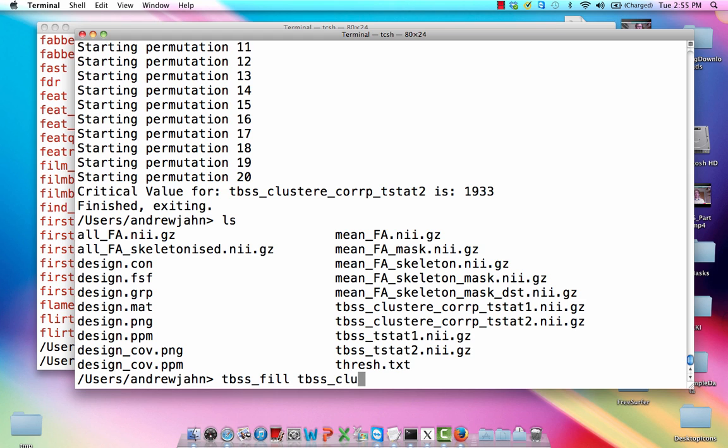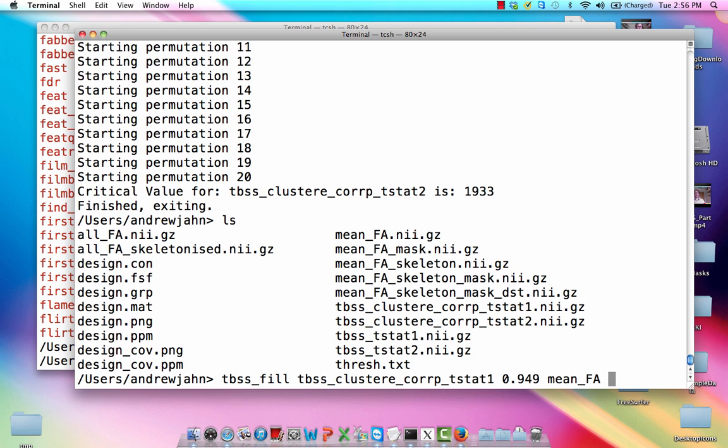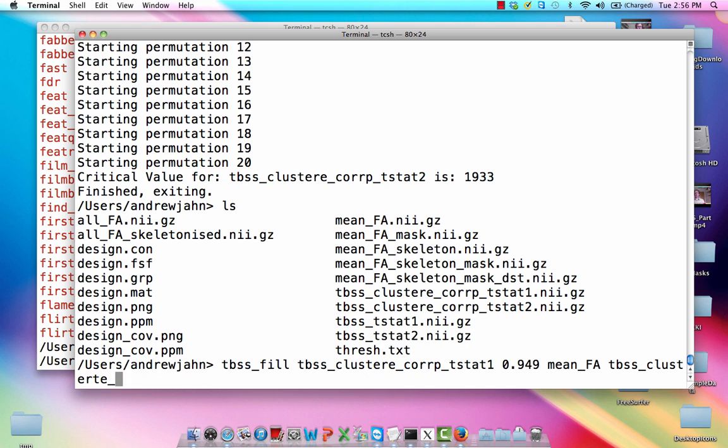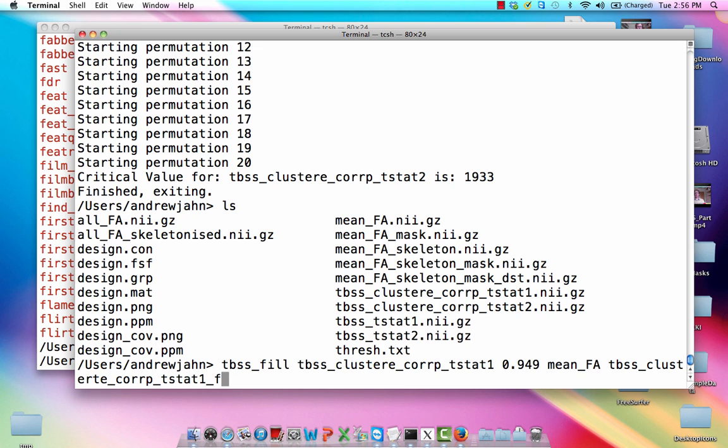And we're going to give it that first contrast image of younger versus older people. And we are going to set a threshold. This is going to seem kind of weird. We've talked about this before, but for FSL, what they usually do is they do one minus P instead of just a P value. So basically what this is going to do is it's only going to show clusters which have a significance level of P less than 0.05. And we're also going to load up the mean FA. And lastly, we are going to call this TBSS cluster core P TSTAT1 filled.